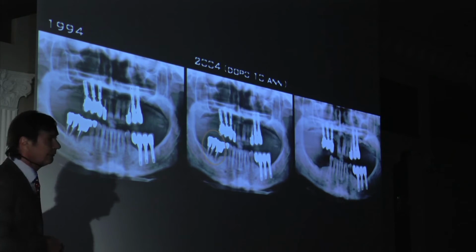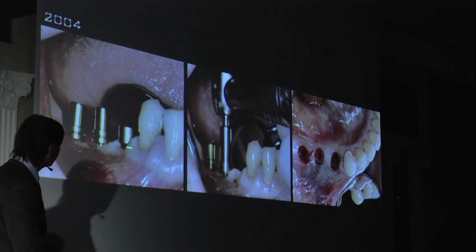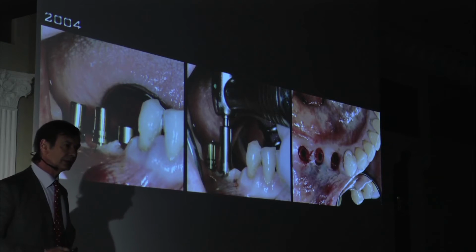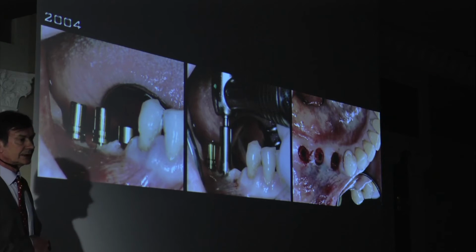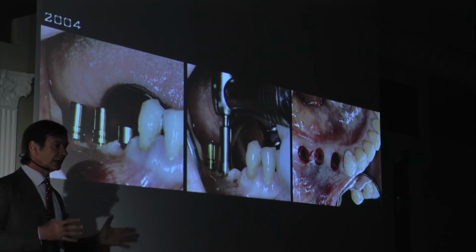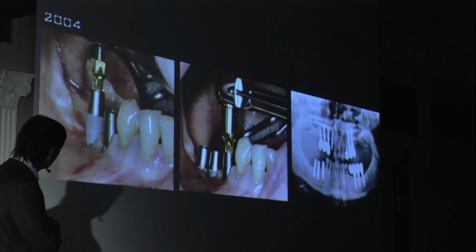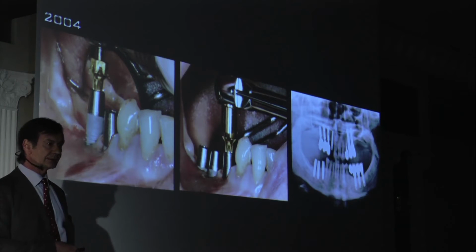But we are in 2004, so we have changed our implants. And this is the kind of crazy procedure that they recommended to us. I was stupid enough to believe it, because I did the flapless surgery without taking care about the keratinized mucosa, because they told us the rough surfaces are so good that the fiber can get attached, so much better than a periodontal ligament. Famous histologist said that. So I placed this implant with the fantastic idea to have the rough surface sticking out from the gums.